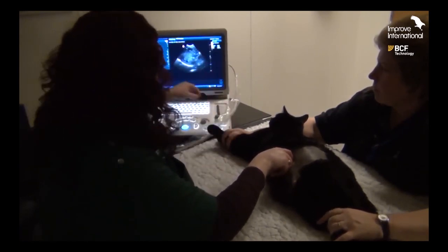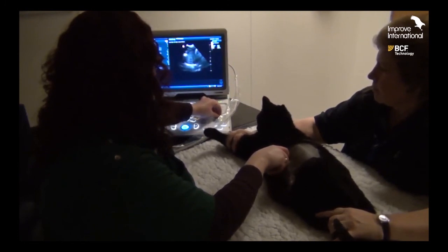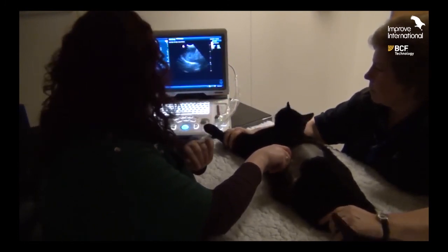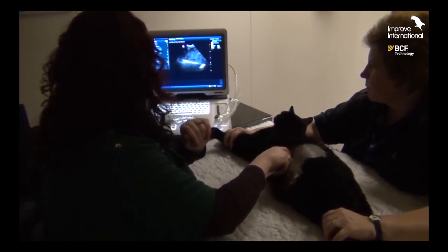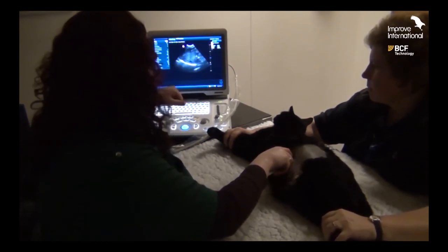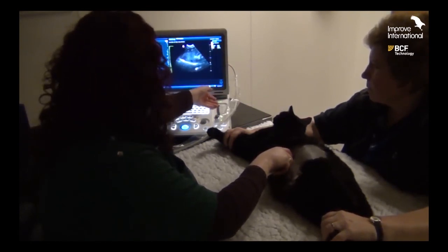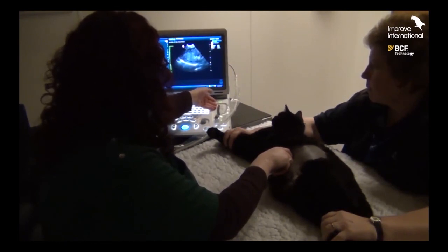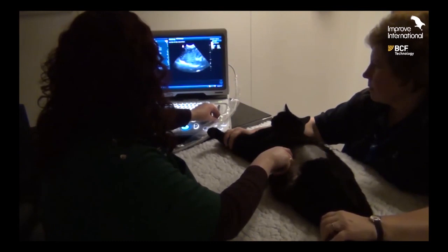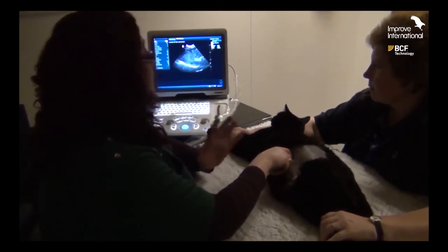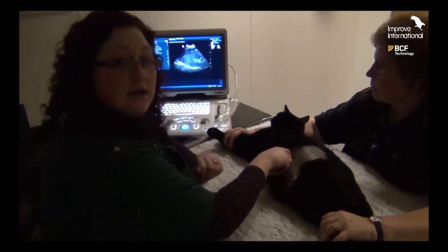We're currently at a setting of 8.5 megahertz, which is quite a high frequency, so we'll drop that down. We've decreased our frequency to improve our penetration. The final control to look at is our focus — our focus is actually at the middle of the liver, so if we drop that down to the deepest part of the liver it improves the resolution all the way through. We haven't looked at our time gain compensation yet, so we look at the image to see how homogeneous it is all the way through, increasing it in the near field. We've changed our depth to be a little more shallow and now we're ready to start scanning the liver — it's nice and homogeneous all the way through, at a good frequency setting, and the patient is calm.